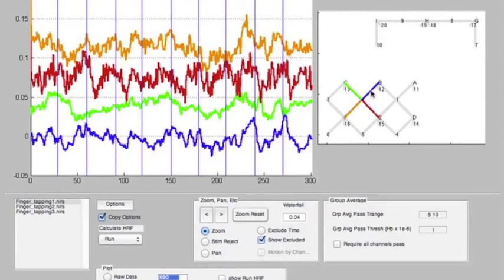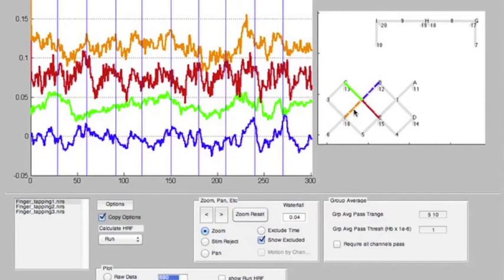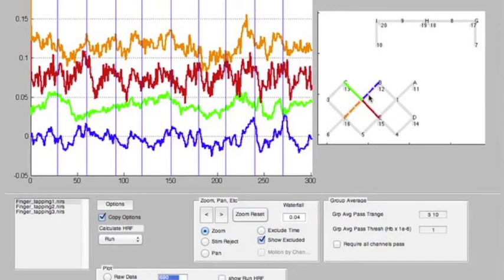Something else you can do is simply click on the color bar connecting the source and detector. What that does is mark that channel of data so it won't be considered in future data processing steps. The function has to be compliant with that so it knows to ignore those channels of data in future analyses.